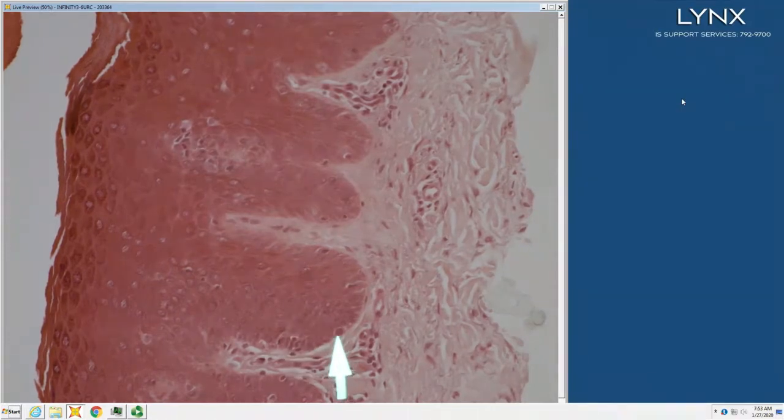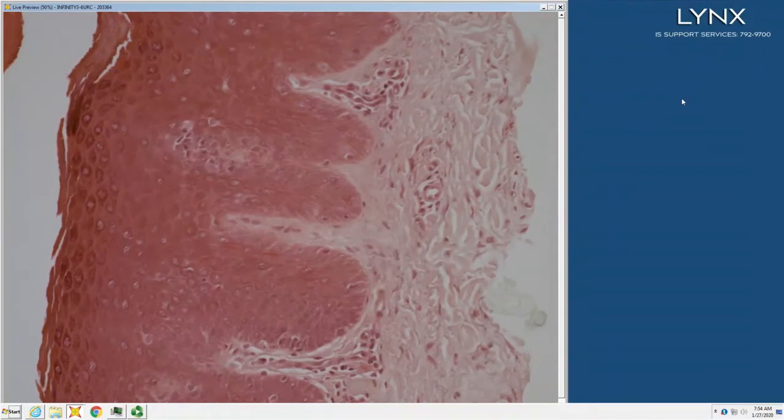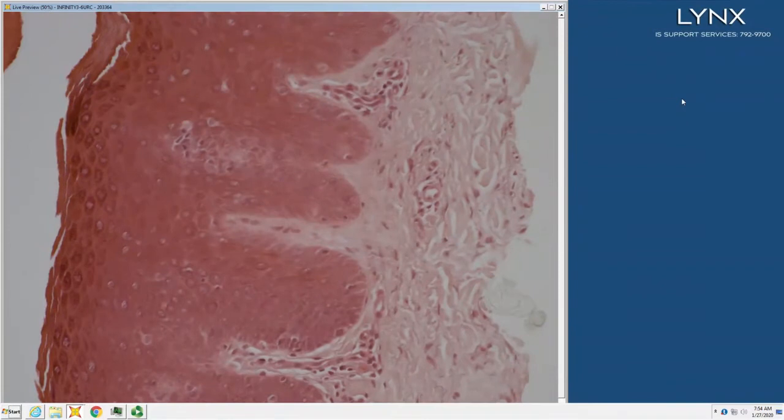There we go. Right there you can see large lymphocytes sitting at the DE junction, ropey collagen above the postcapillary venule, and this is mycosis fungoides. Probably someone who's been under treatment so that all of the benign recruited lymphocytes are gone, and all that remains are those few big MF cells sitting tagging at the DE junction.